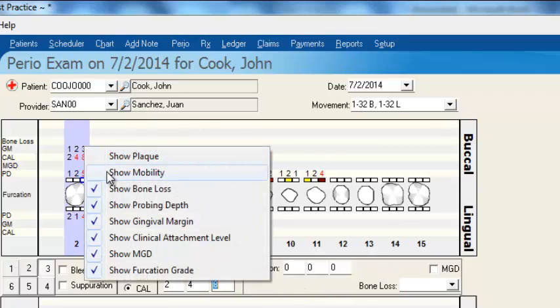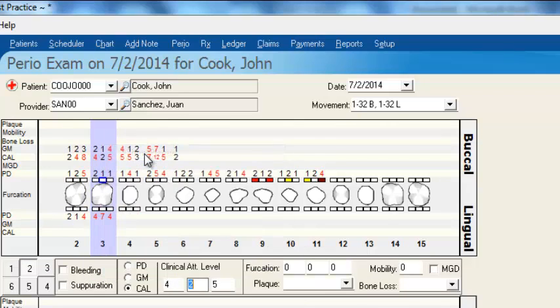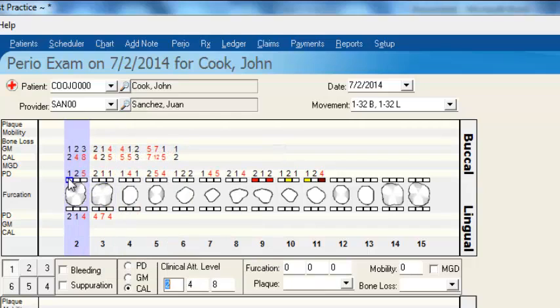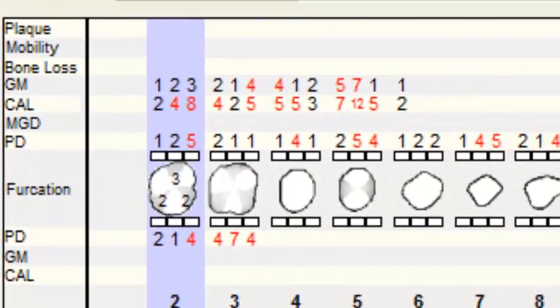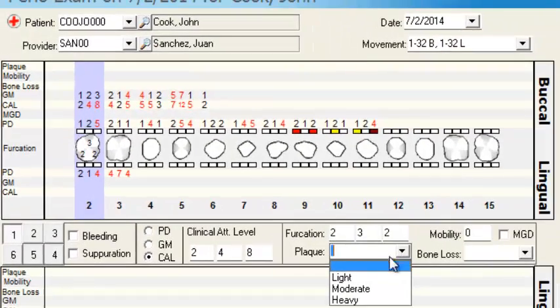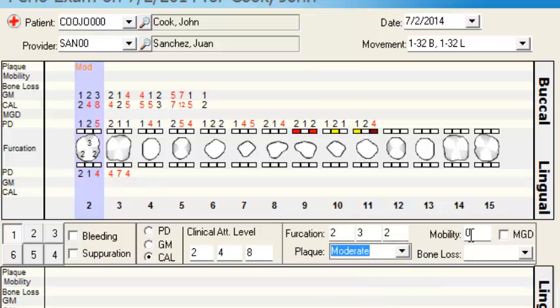I'll go ahead and add them back in — mobility and plaque level. Going back to tooth number two, we have furcation grades that we can record for the molar. Plaque level is back now, and we can record by tooth: light, moderate, or heavy plaque level.